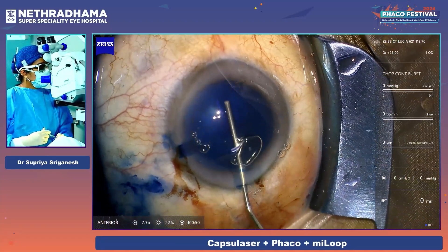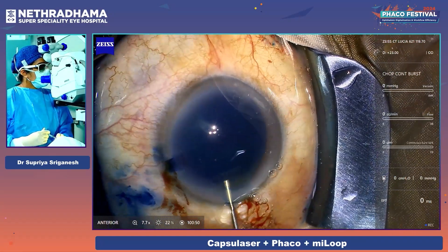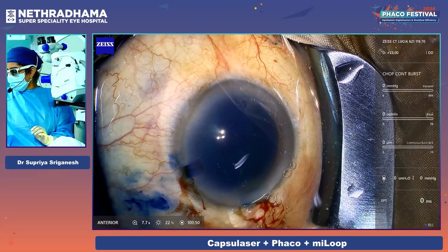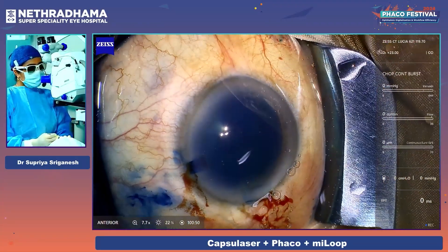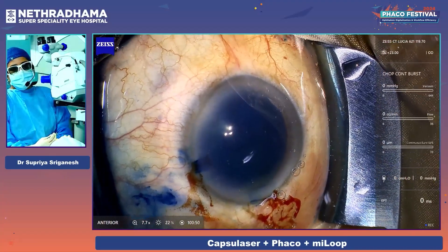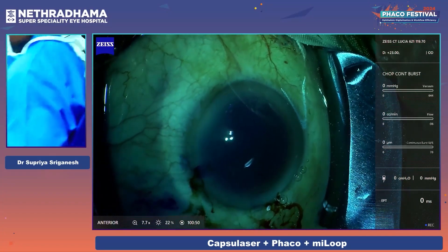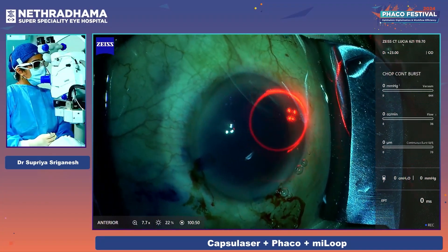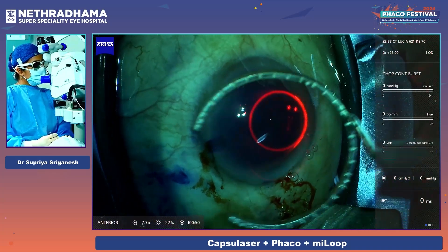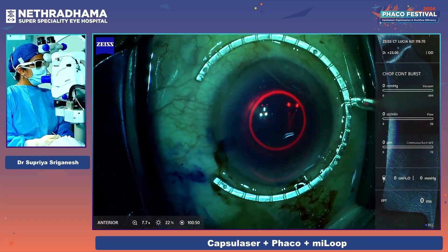This is sodium hyaluronate. It's important to fill the eye well. I'm just using a fixation ring. The laser is slid into position — as you can see, the laser is now in position. I'm using the different foot pedal to switch on the laser. Can you see the ring? I'm using a fixation ring to get the eye into the right position.